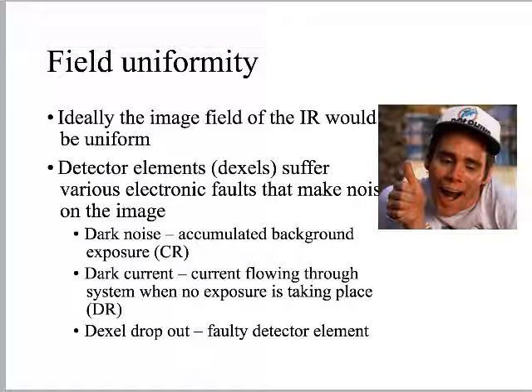The way that the computer corrects for this, I'm going to toggle over here real quick to our reading, is it applies a test like this. Before anything is done with the image, it measures this background field of the CR plate or the DR plate. Sometimes this has to be done by the physicist. Sometimes it is done prior to any image exposure, right?